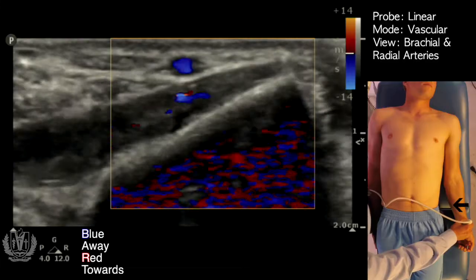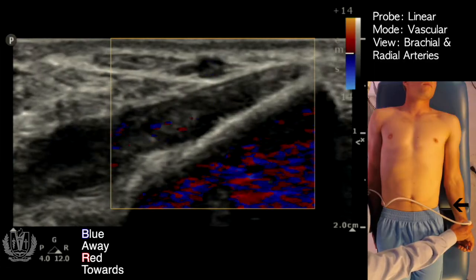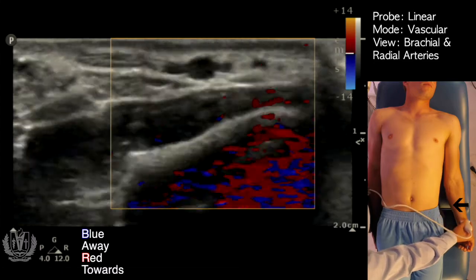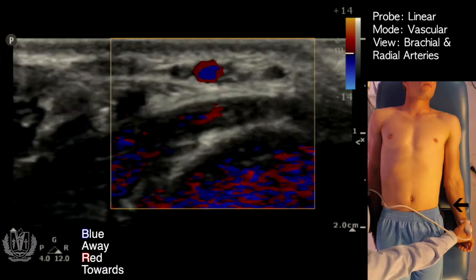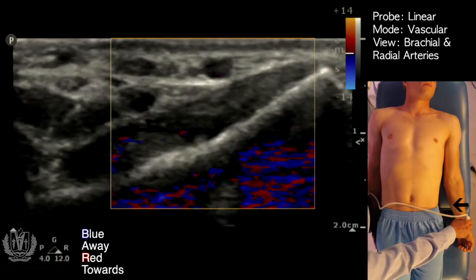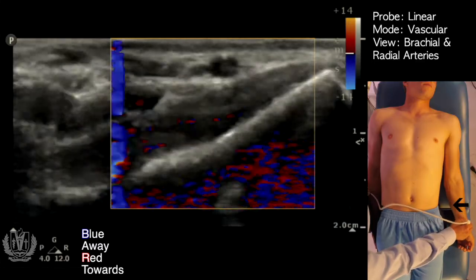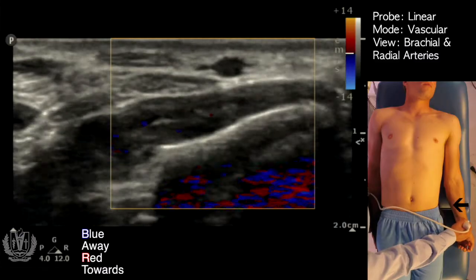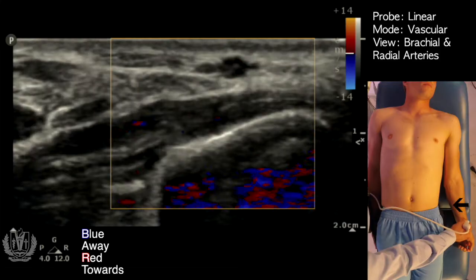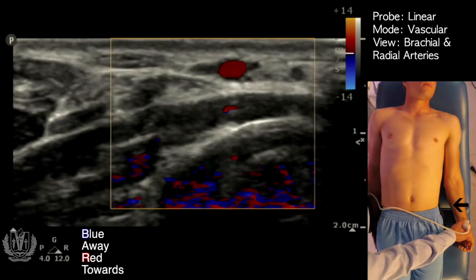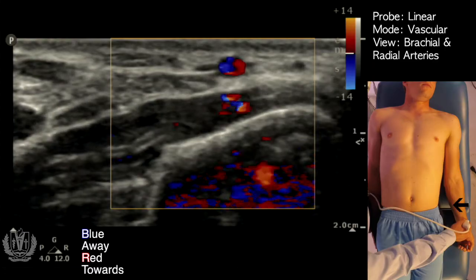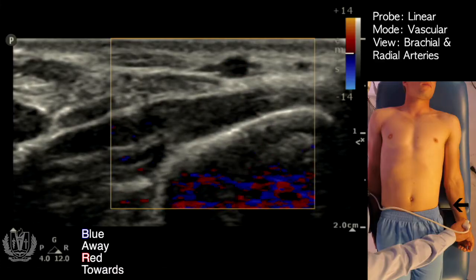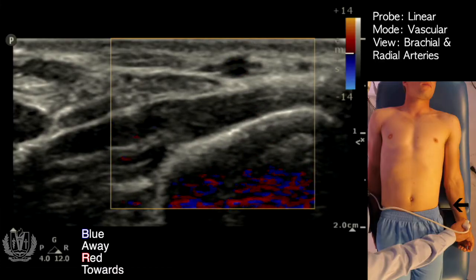A lot of people think that color Doppler means red means artery and blue means vein. It actually has to do with the direction of flow — is the velocity of flow going towards the probe? Then it looks red. Or if it's going away from the probe, it looks blue. And if you're perpendicular to the flow, you'll notice it turns black, or you see both red and blue mixed, because the flow is neither towards nor away from the probe — it's perpendicular to it.